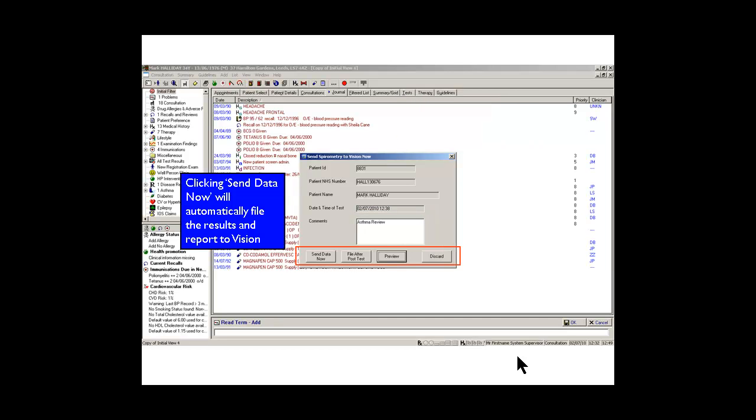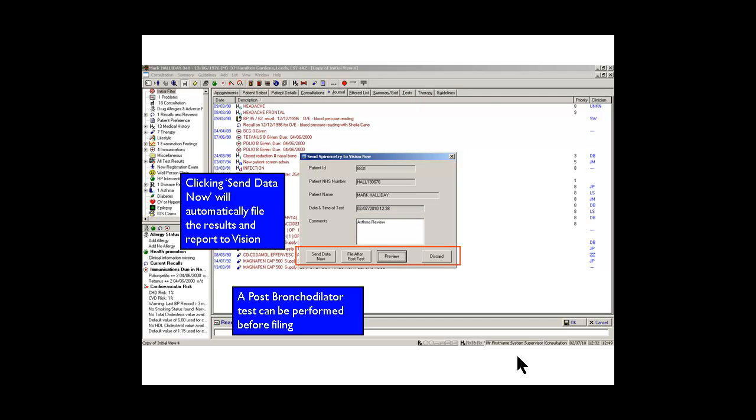We can send the data now to the record and it will go straight onto the record. But normally if you wanted to do a post bronchial dilator test you would give the patient the inhaler, send them out for 10 minutes, let them come back in and we would perform the reversibility test at that point.